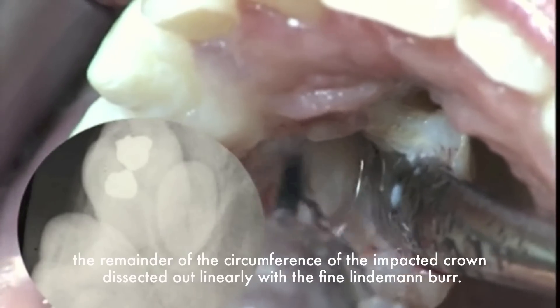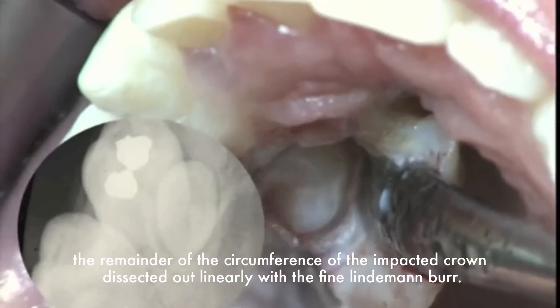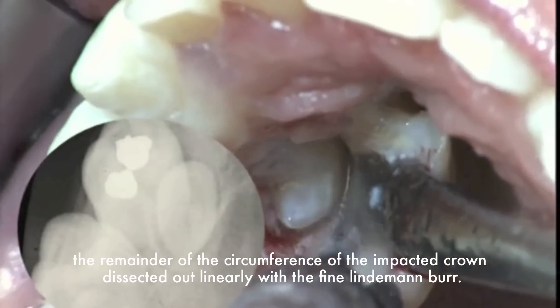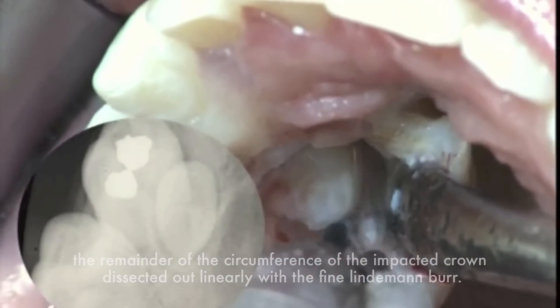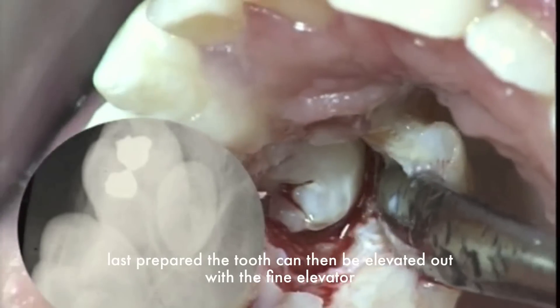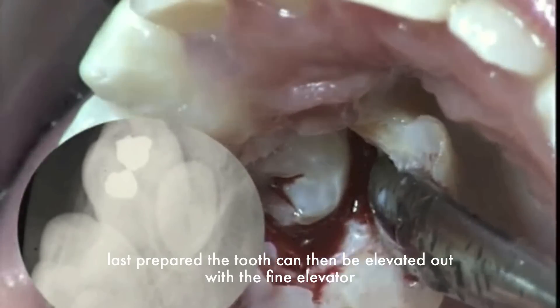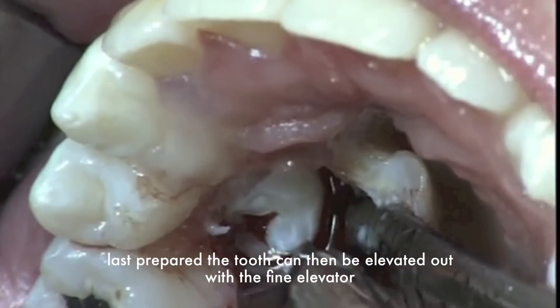The remainder of the circumference of the impacted crown is dissected out linearly with a fine Lindemann burr. Thus prepared, the tooth can then be elevated out with a fine elevator.